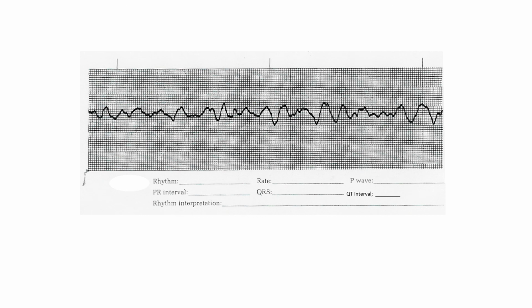You're going to get a defibrillator, or somebody's going to bring a defibrillator, hopefully. As soon as the defibrillator comes, you're going to stop CPR and defibrillate as fast as you can, and then resume CPR. After 2 minutes, you're going to check again. If they're still in V-fib, you're going to defibrillate again.